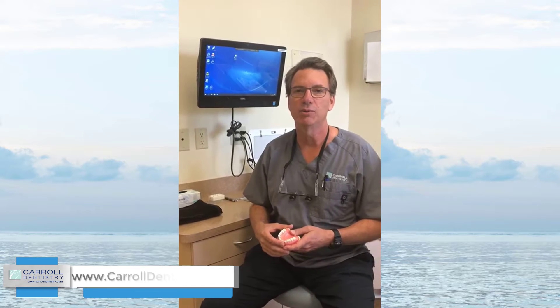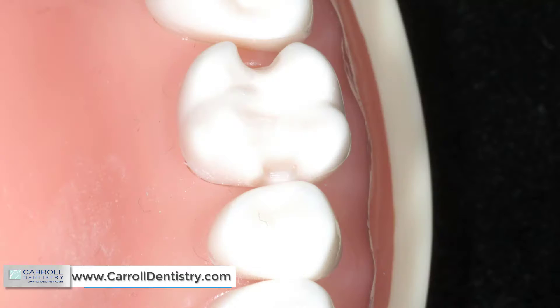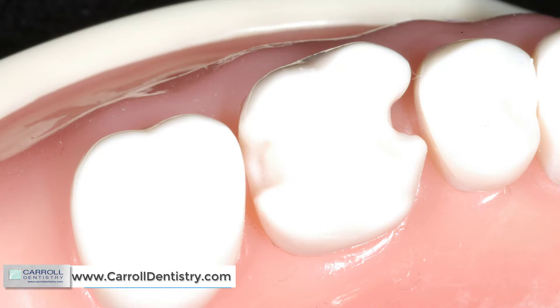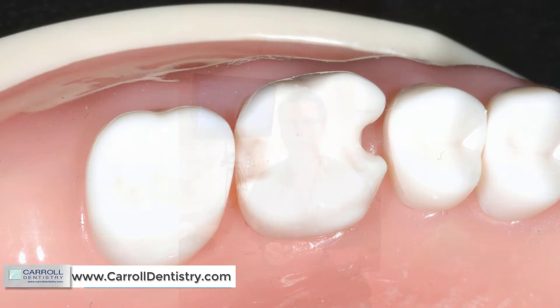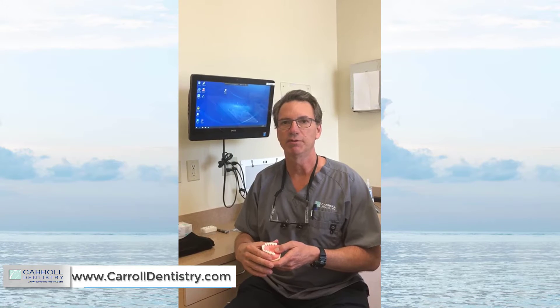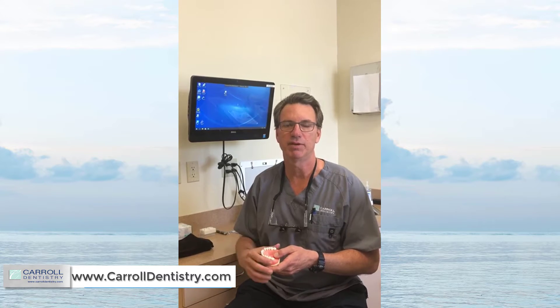One of the questions we get during regional courses is, when we restore the class twos on this model, how do you prep that Clark class two minimally invasively? When I came through dental school we were prepping class twos with a 557 or a 56 bur — that is not the way to prep a minimally invasive class two. In this video we're going to go through just the preparation: how to do a minimally invasive Clark class two prep.